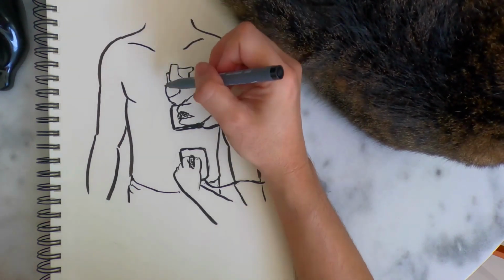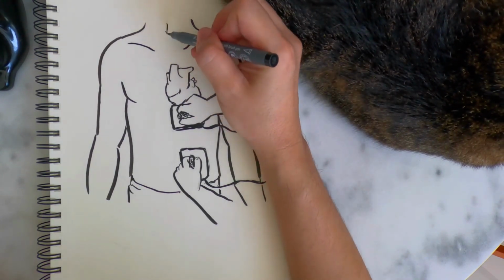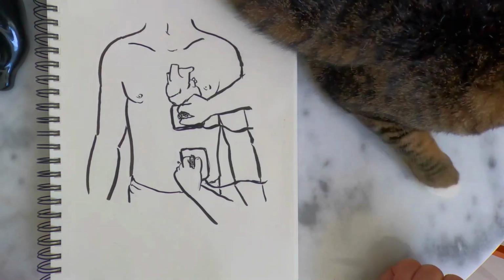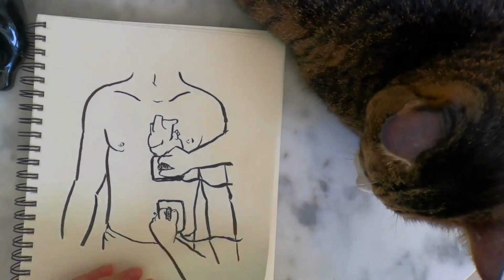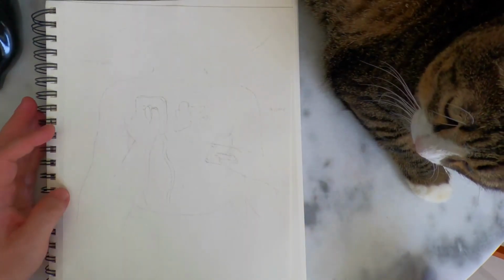If we place it there, the current will flow directly to the heart. If we place it incorrectly, the electricity won't pass through the heart. It will go through the abdomen instead, wasting a lot of energy. If the positioning is not appropriate, it won't help at all. Let me show you another image to illustrate the correct positioning.